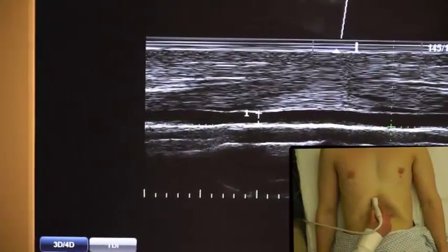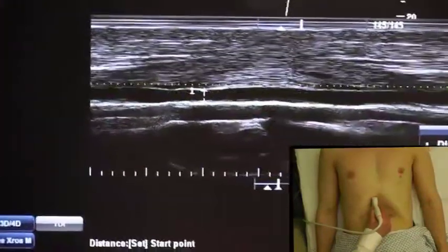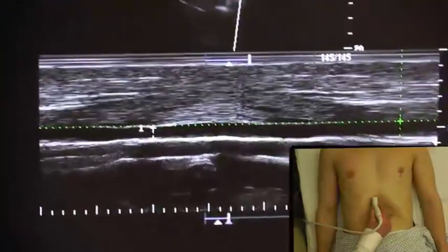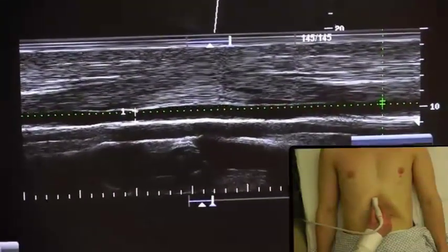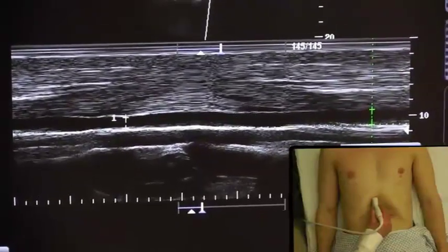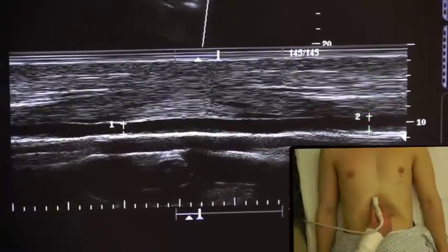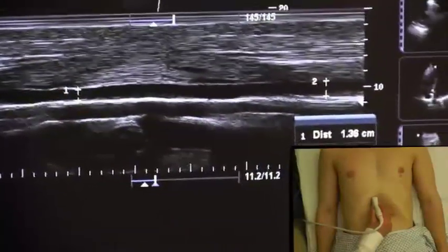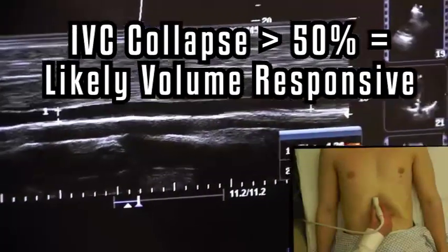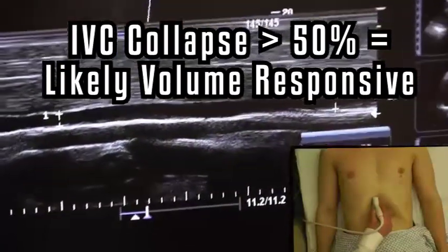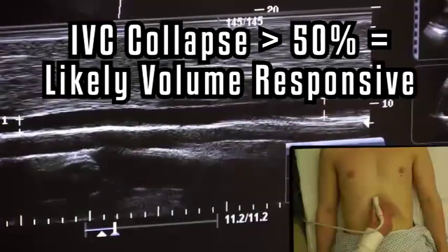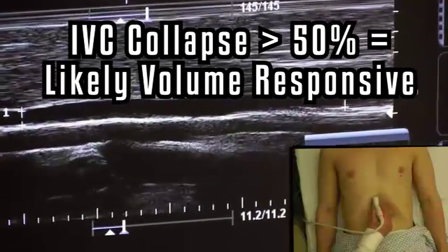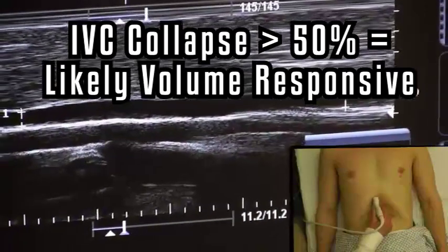First, I'll measure the inspiration portion of the IVC, and then I'll measure the expiratory portion of the IVC. A quick and dirty standard is that if the IVC collapses greater than 50%, the patient is likely to be volume responsive.